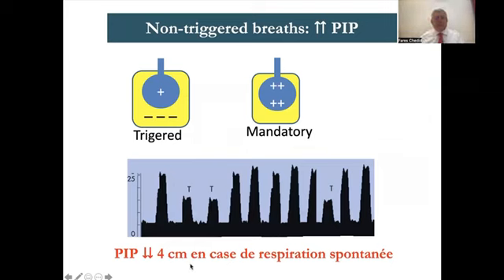Something I didn't say in the introduction of the volume guarantee: I said that the volume of each breath will order the pressure of the next breath. But that's in fact wrong, because the system knows when the patient helps the ventilator by breathing in with it. When the breath is triggered, it will produce more volume and require less pressure. So look at a triggered breath here.